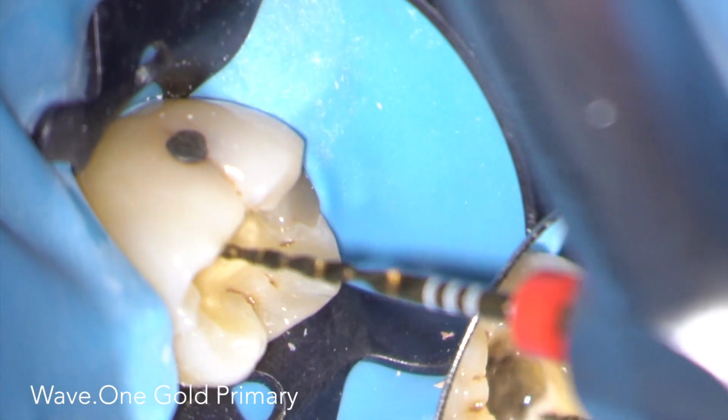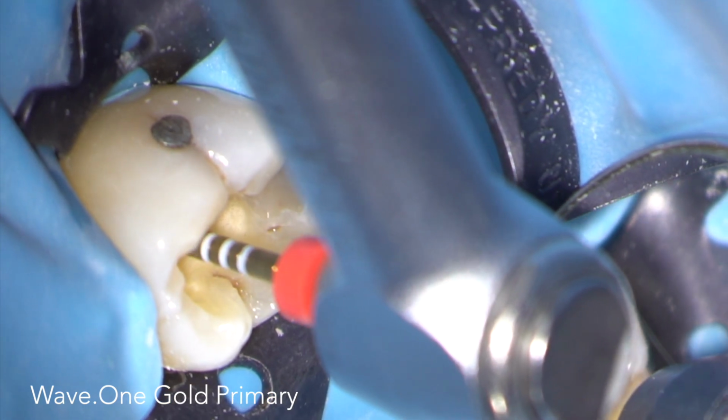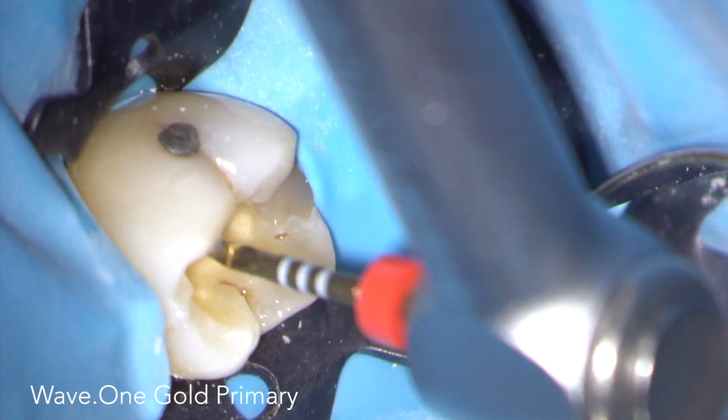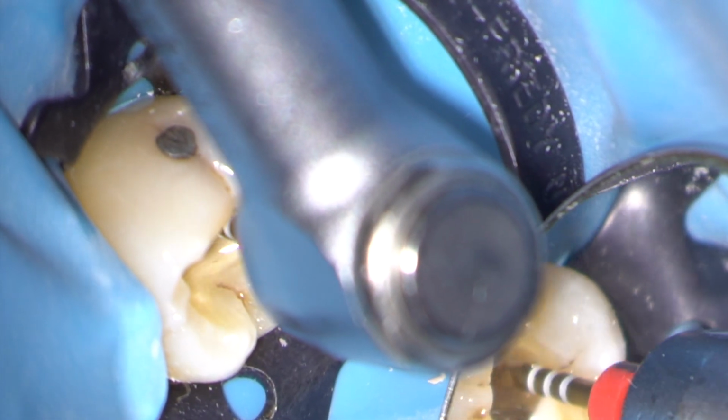Here I'm completing preparation using a primary Wave.One Gold instrument. In the case of the canals where there are fractured instruments, one canal I managed to bypass, and in the other I'm preparing down to the level of the piece of instrument.